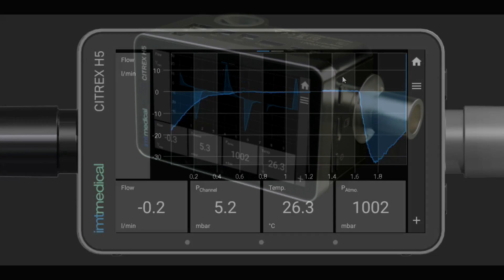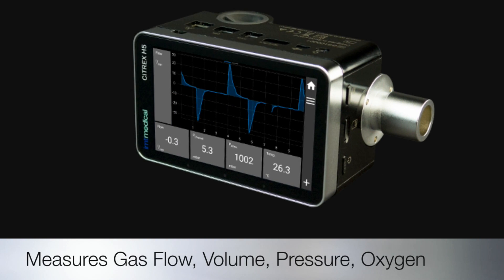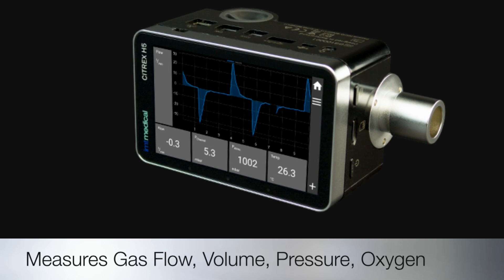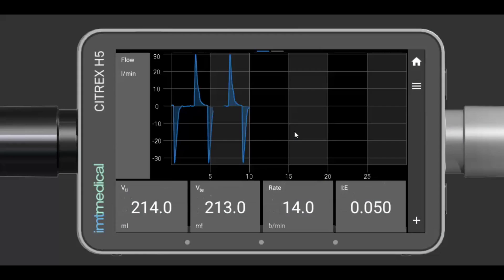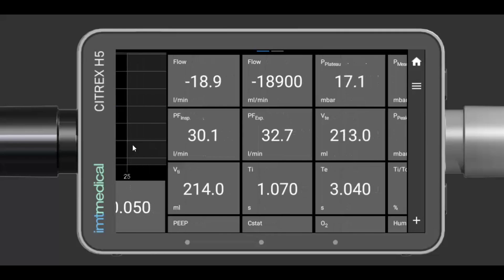It's portable, accurate, and enables users to individually configure their measuring screens. The new Citrex H5 is designed to meet a wide variety of day-to-day applications.